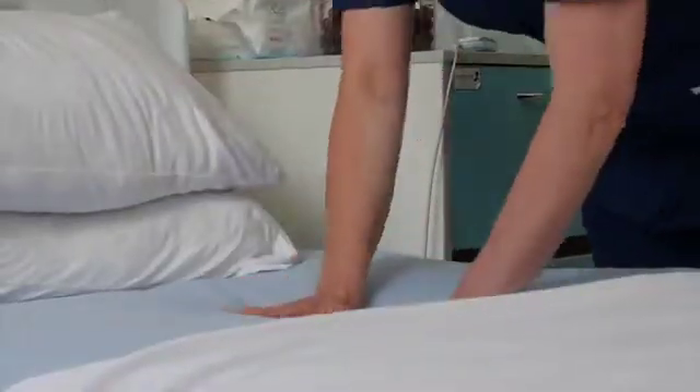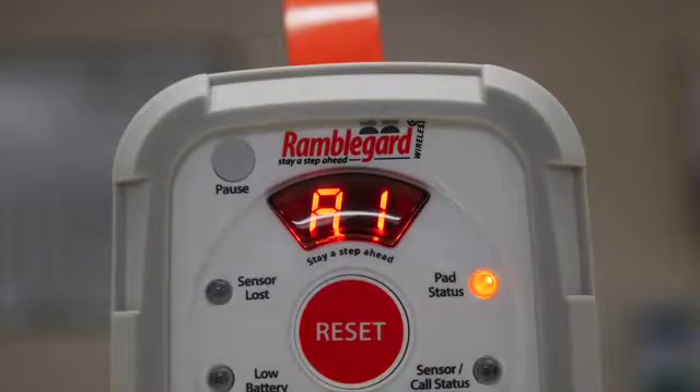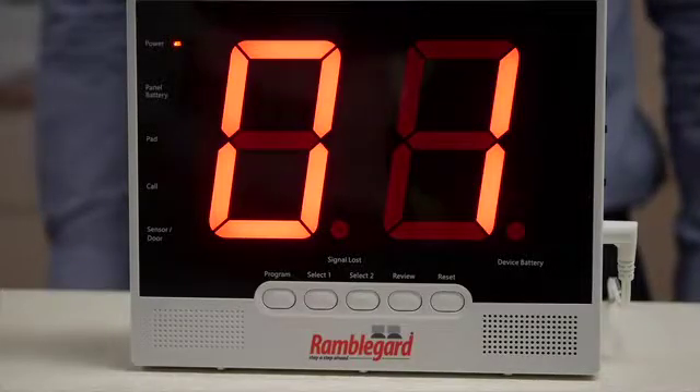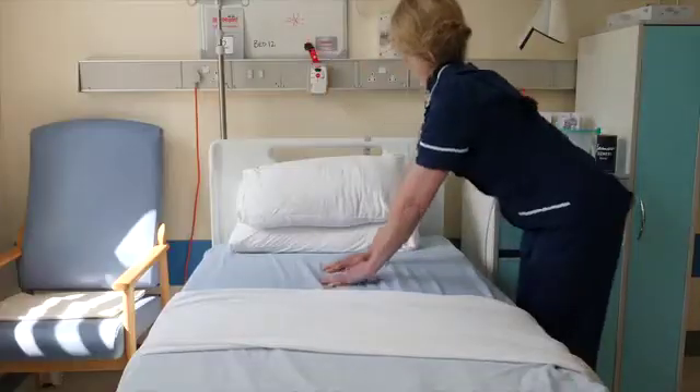The companion monitor status light will flash twice and the set number will display on the master display panel for approximately two seconds, confirming that the system is now active.